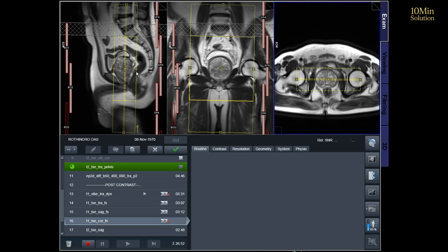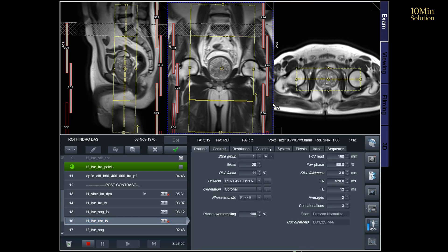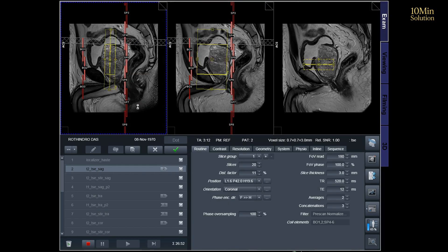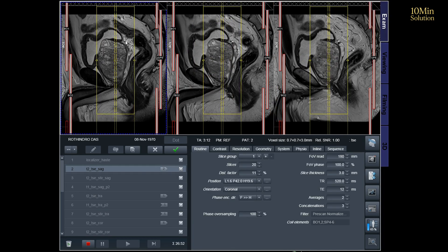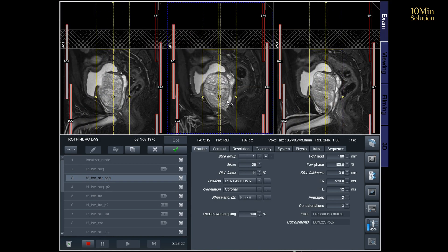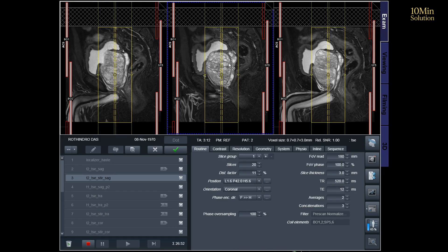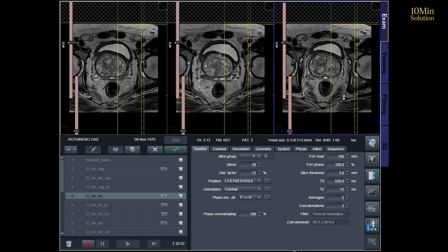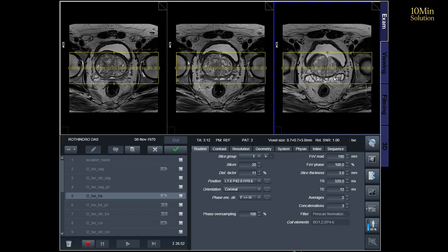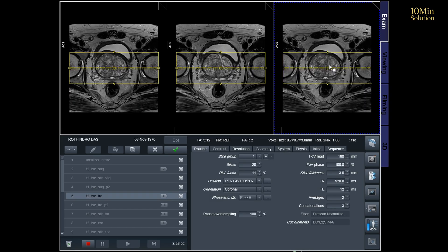T2C Coronal Planning: Plan the coronal slices on the sagittal plane and angle the positioning block vertically across the prostate, as shown in the picture. Check the positioning block in the other two planes, ensuring an appropriate angle is given in the axial plane, parallel to the right and left hip joints or ischial tuberosity. The slices must be sufficient to cover the entire prostate and seminal vesicles.